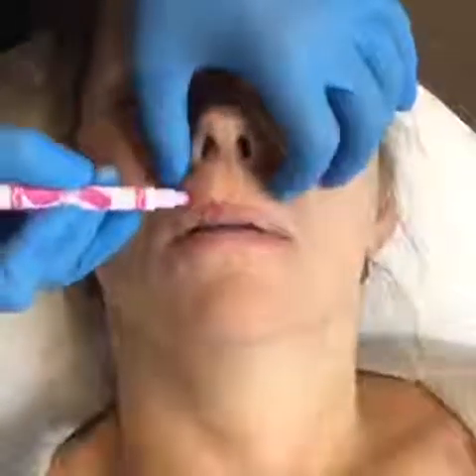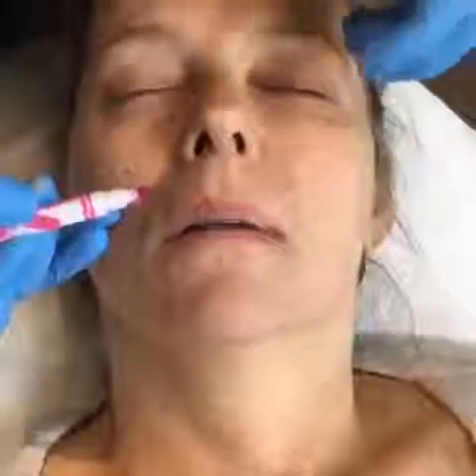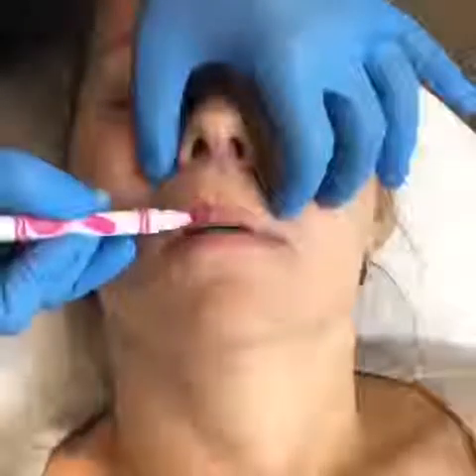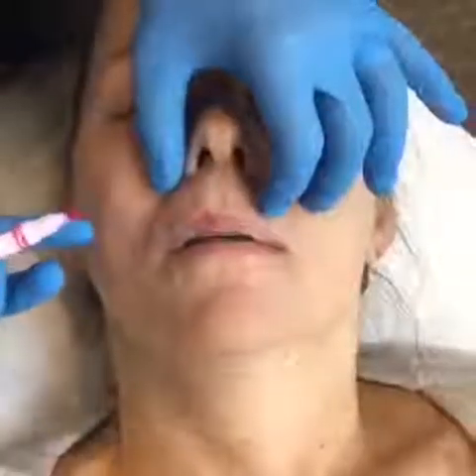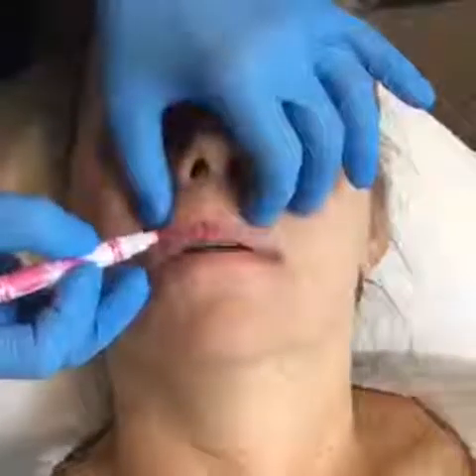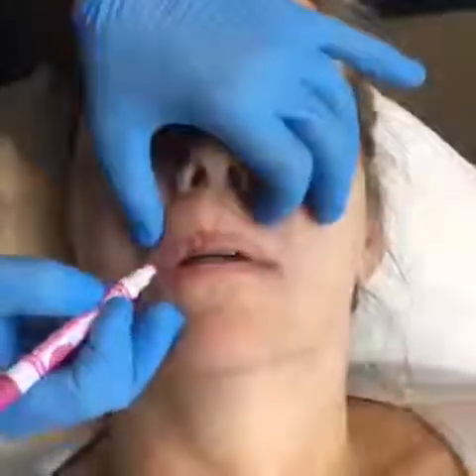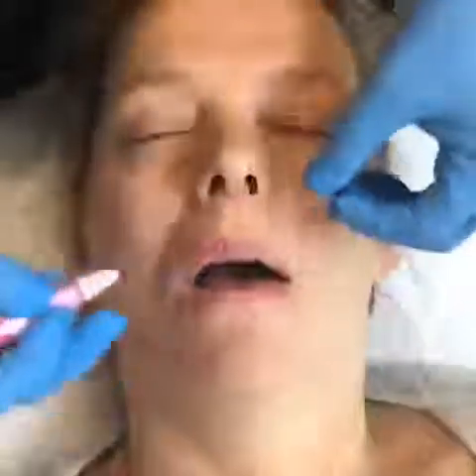When I'm injecting, I titrate my filler into little insulin syringes. We show that in a separate video. Then I do a central stalk with 3 retrograde injections, but 1 entry point. My second fan, I line up so the most medial aspect of the second fan hits the lateral aspect of the first. You want to basically join that product together. Open just a touch. And on some people, you can actually do a third little V on the other side.